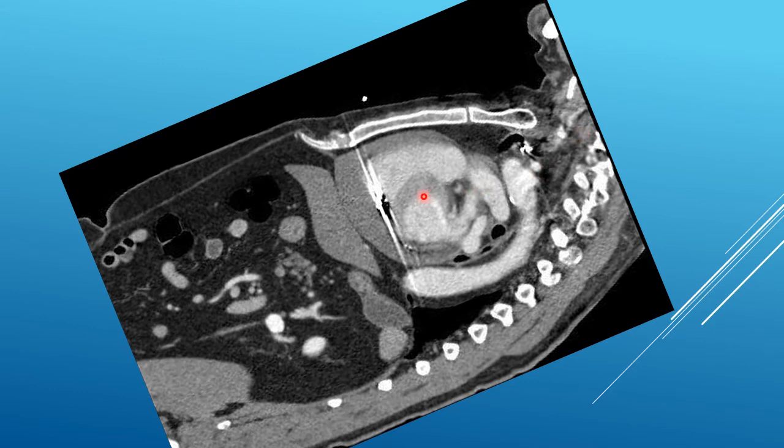This is another example. Here, a pacemaker has caused the pericardial effusion. There's nice separation between liver and sternum, and we could simply go in at a 40-degree angle and get straight in with an excellent amount of depth there. Often there might not be as much fluid here, and the classic approach aims to have more of a 30-degree angle that allows us to have a greater depth separation by going more obliquely.